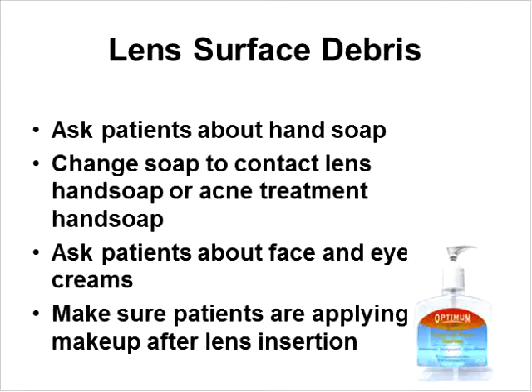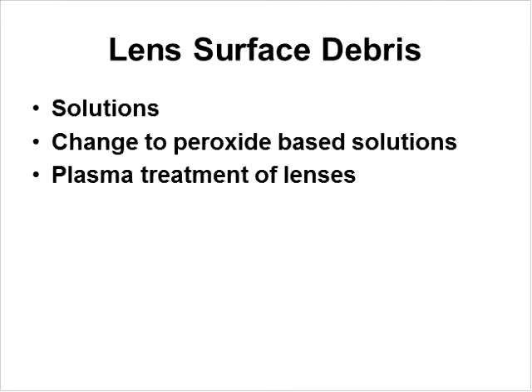Here you can see an example of one, or special hand soap for acne treatment. It may be beneficial to change to peroxide-based solutions and also plasma treat the lenses.